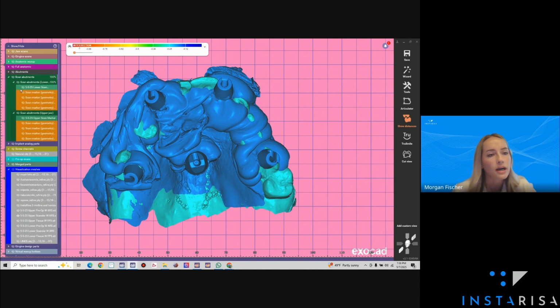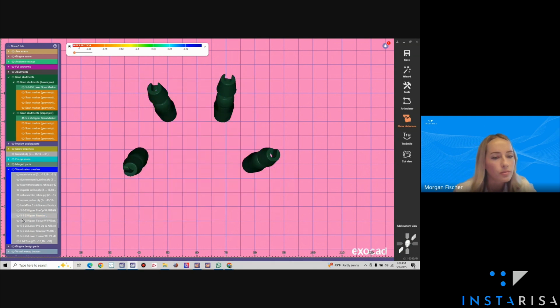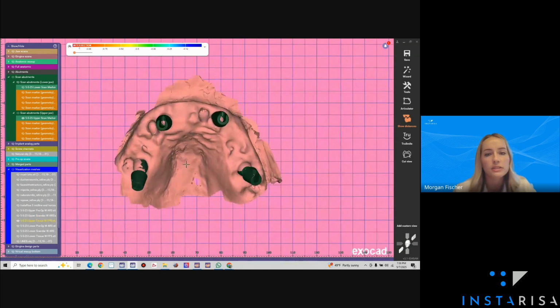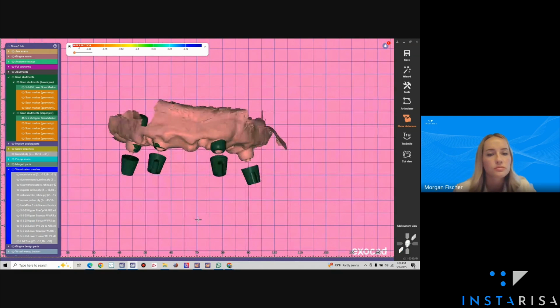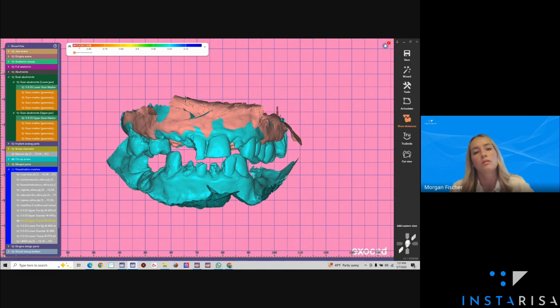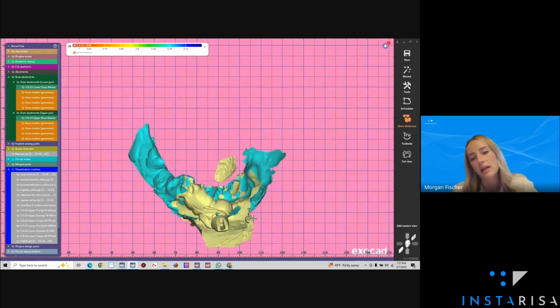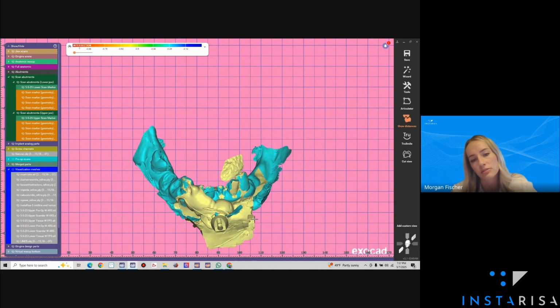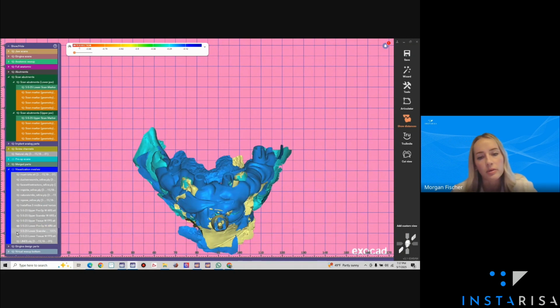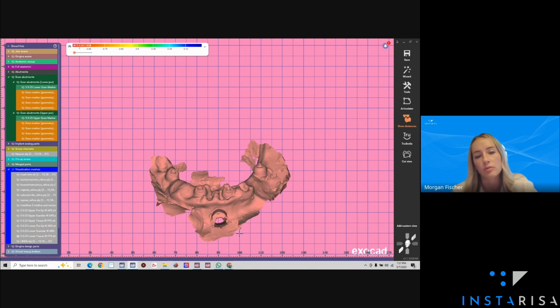From that, I can grab my implant marker position right here. And then from there, I have my upper tissue. Same thing on the lower. On my lower, we have a fiducial marker placed right into the mentalis area. Alignment looks really good. And then we have our lower Scandar. That's where I'm going to get my implant position. And then we have our lower tissue.